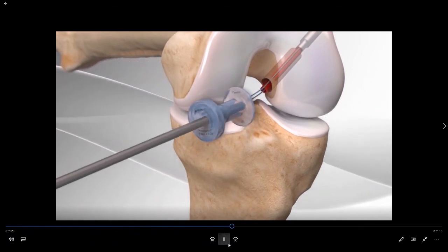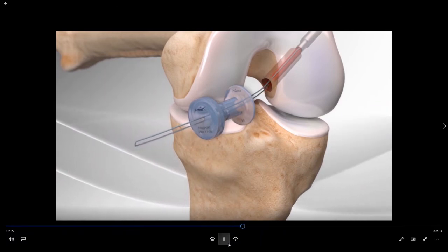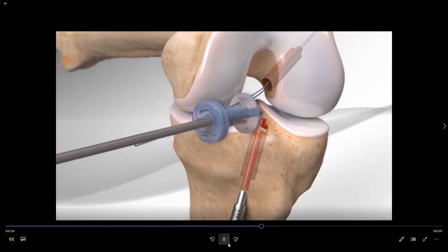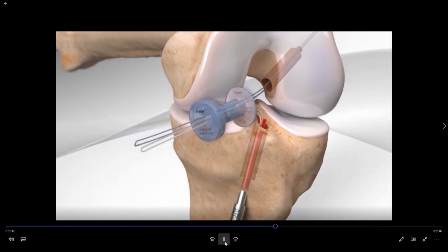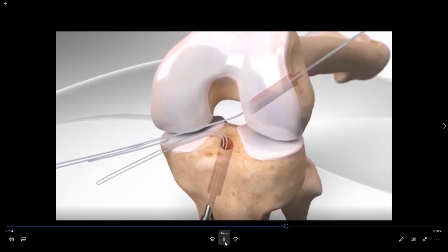We then place a stitch through that socket, retrieving it out of the body through a portal. We then drill an identical socket on the tibial side to the appropriate diameter, and pass a second stitch through the tibial socket in order to advance the graft.